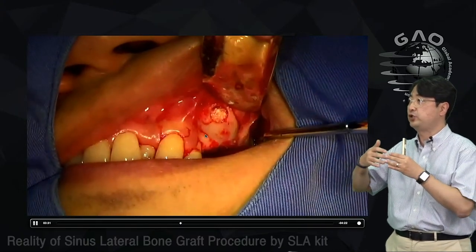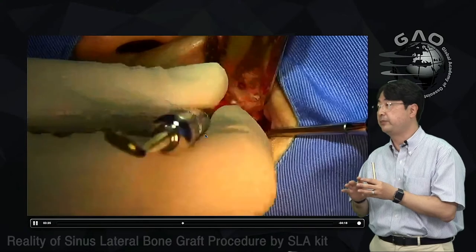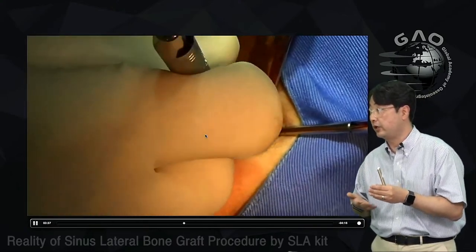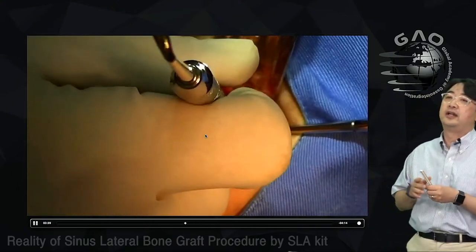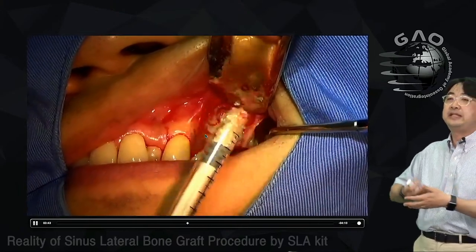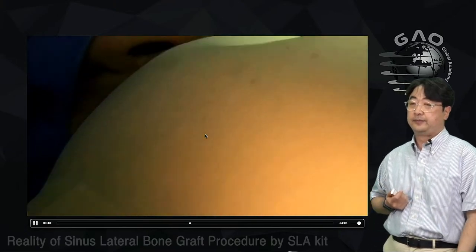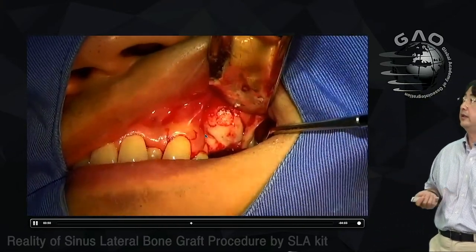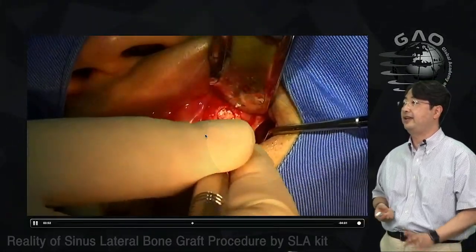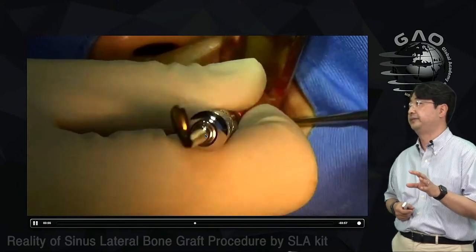Once I finish the distal, I move to the medial and anterior part. Then I finish with the middle part. Once you finish the middle part, the graft won't go into the anterior medial part. That's why I like to do distal first, fill the bone distally and medially, then go to the middle part. This time I use FDBA and alloplast material in about the same amount.